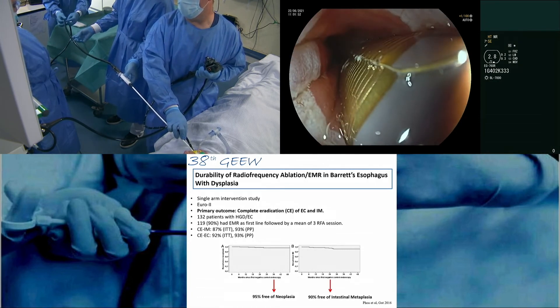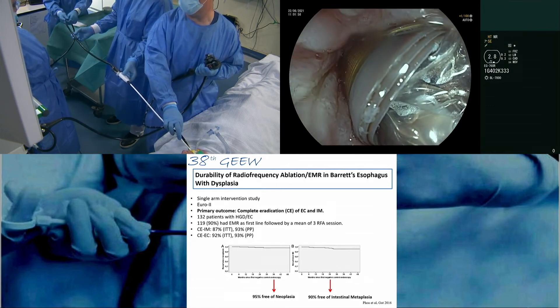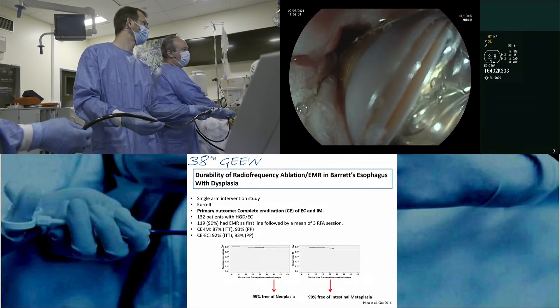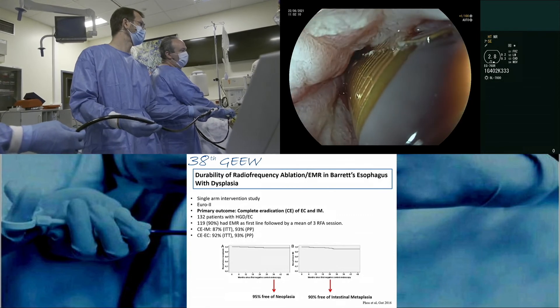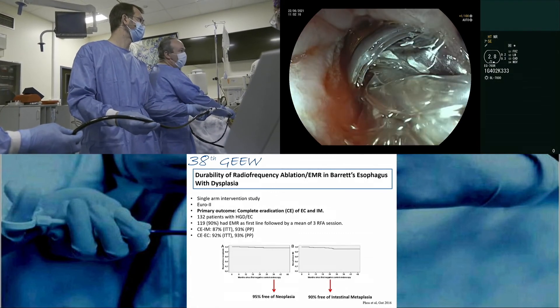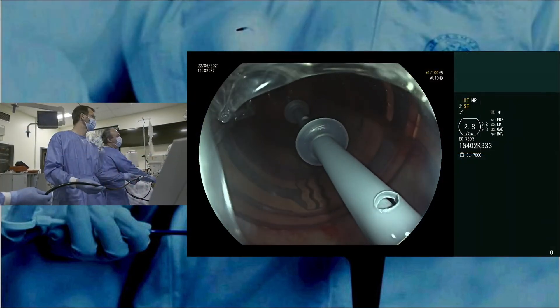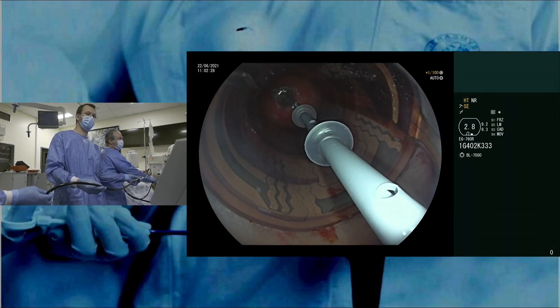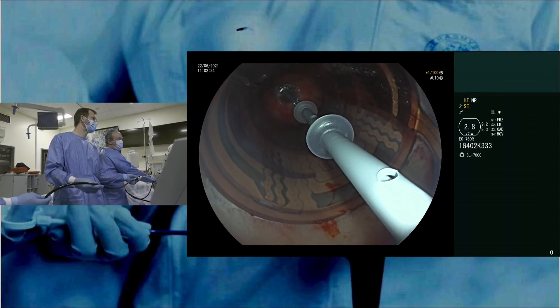We know that the chances of full ablation are smaller in longer segments, but it's still feasible and we have very good responses. Sometimes in these long-segment Barrett's, you come back and they have more than 90% regression. So you look for the distal margin of the ablation here, take about half a centimeter of ablation zone back, pull back the scope, fix everything to the bite block, and go for the third ablation zone — we probably need four zones in this long-segment Barrett's. We're now at 27 millimeters, which is 10 millimeters more than at the top, clearly illustrating the advantage of this adaptive balloon.